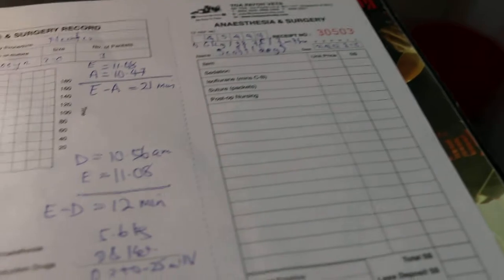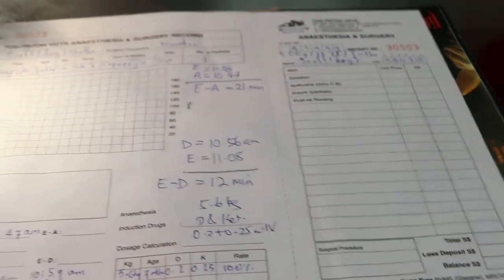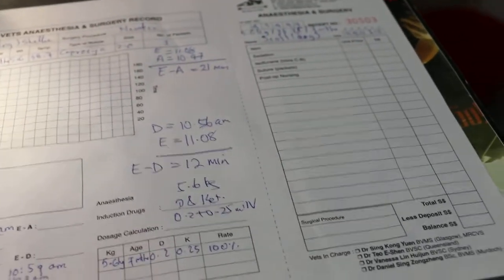This anesthetic can last quite long, but the best is to neuter within 5 minutes of injection. In this case, the injection was given at 10:47 and the first skin incision was at 10:50.